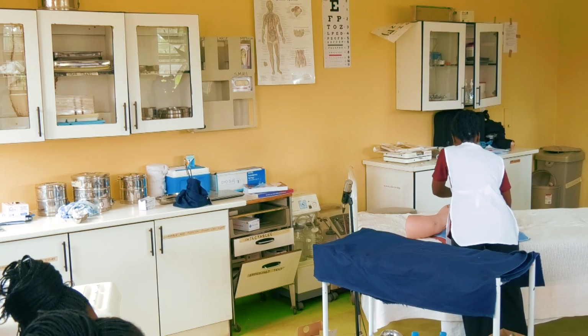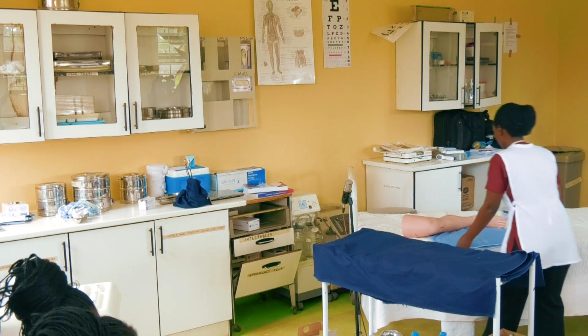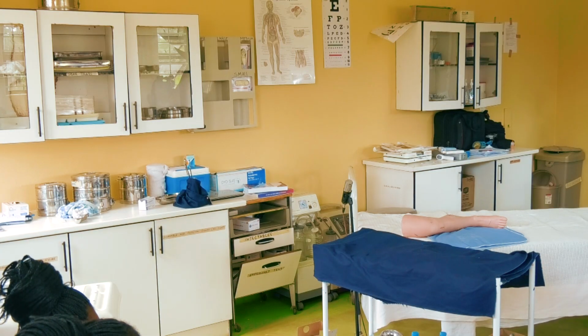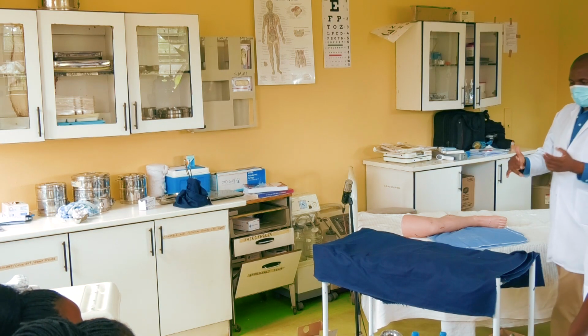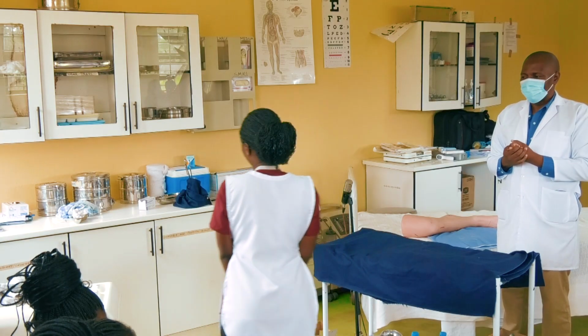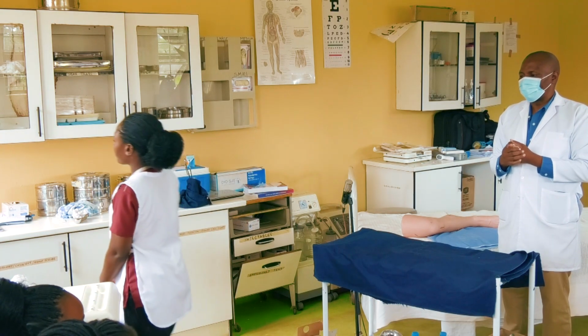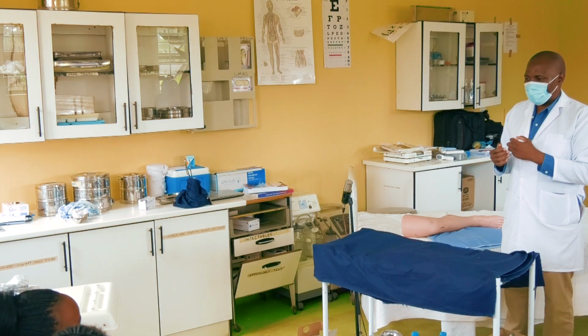Everything you are doing, remember you are talking to your patient. Since she has touched these things, when you come back to touch my trolley, she has to go and wash hands and dry them. So go wash hands, dry them. You can come back.